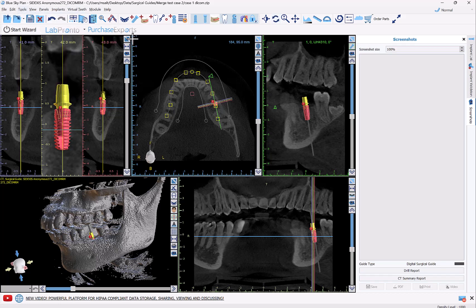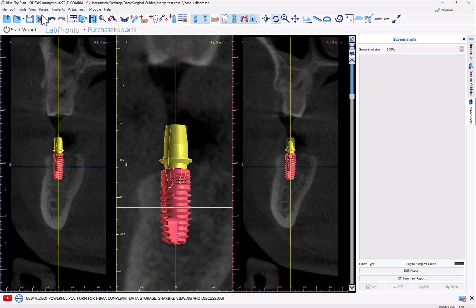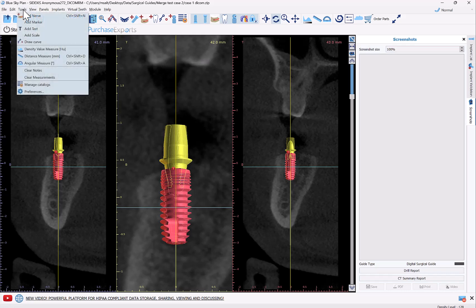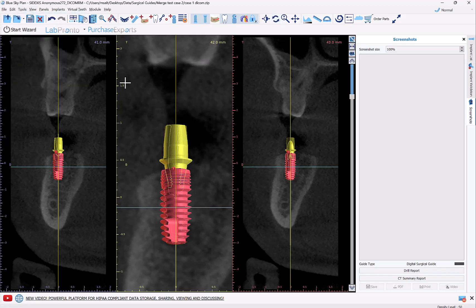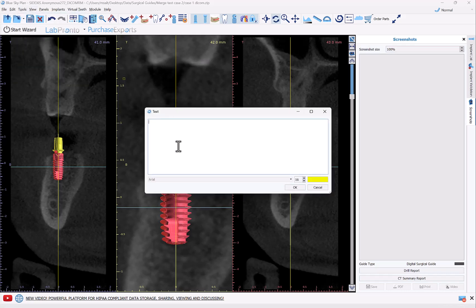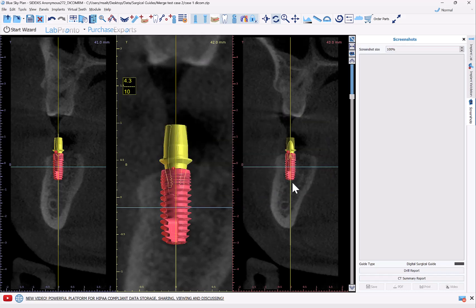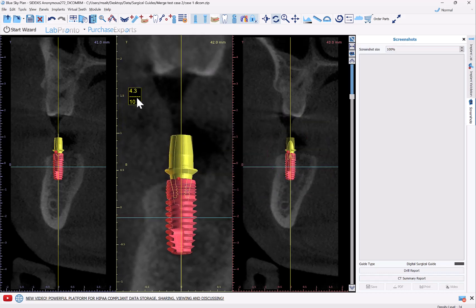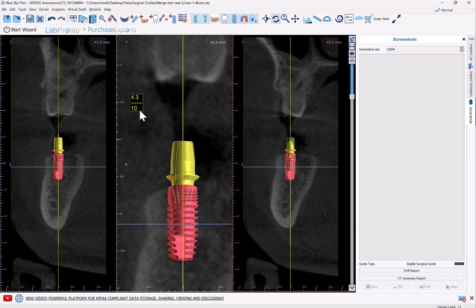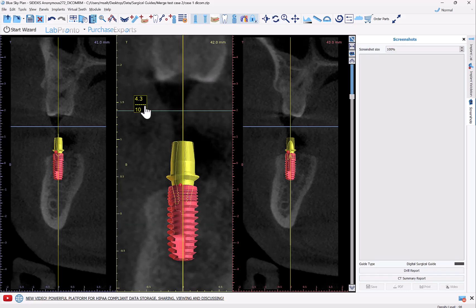Let's make the view bigger first, then go to Tools > Add Text. If you want to include any notes to yourself — or the implant size, for example — you can type whatever you want into the text box, change the size, change the color if you like, and then click OK to have the text appear on the screen.